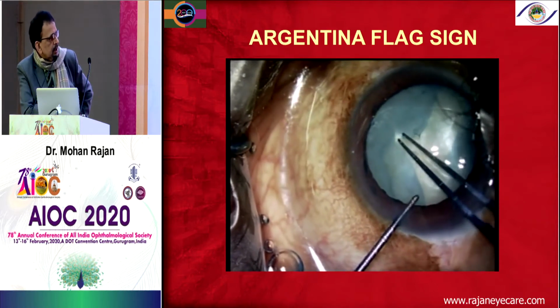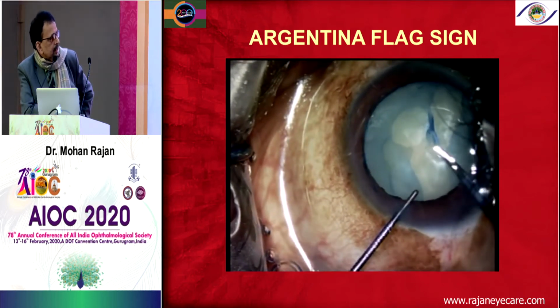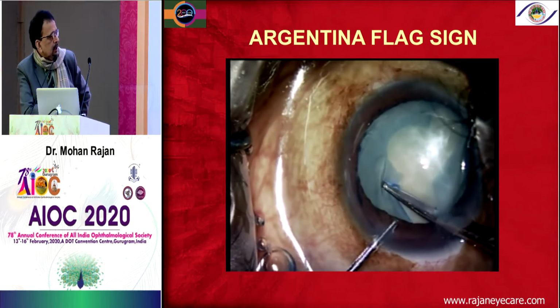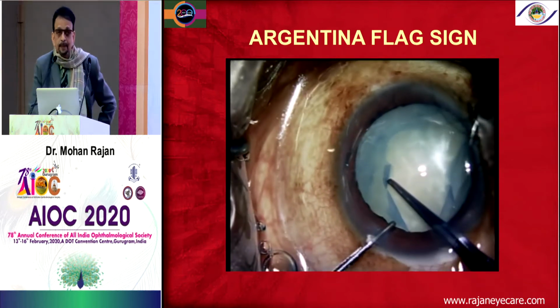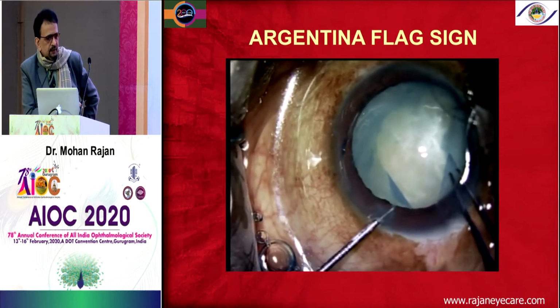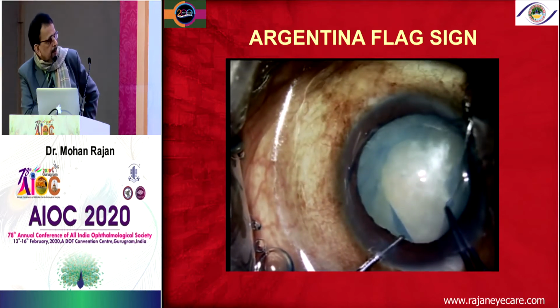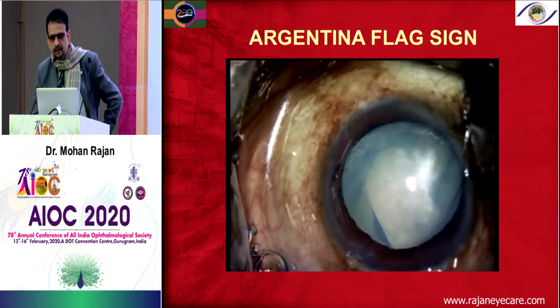You can see here, what I'm trying to do is, I'm doing a semicircular rhexis on one side, and then I have another semicircular rhexis on this side as well, making sure that I don't have any flaps during my phacoemulsification. This is a fairly soft cataract, grade 1 to 2. Though it's a white cataract, it's a fairly soft cataract. So I thought I'll go ahead and do a phacoemulsification. I'm making sure that before I do the phacoemulsification, I'm converting that into 2 semicircular rhexis.